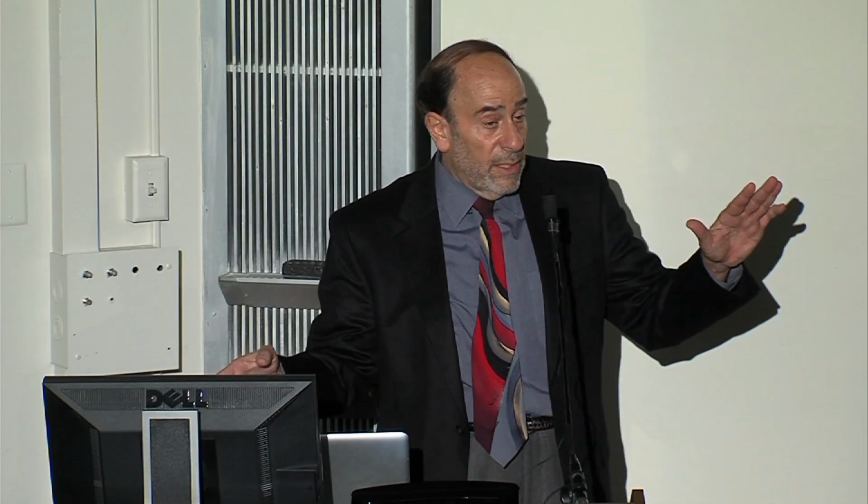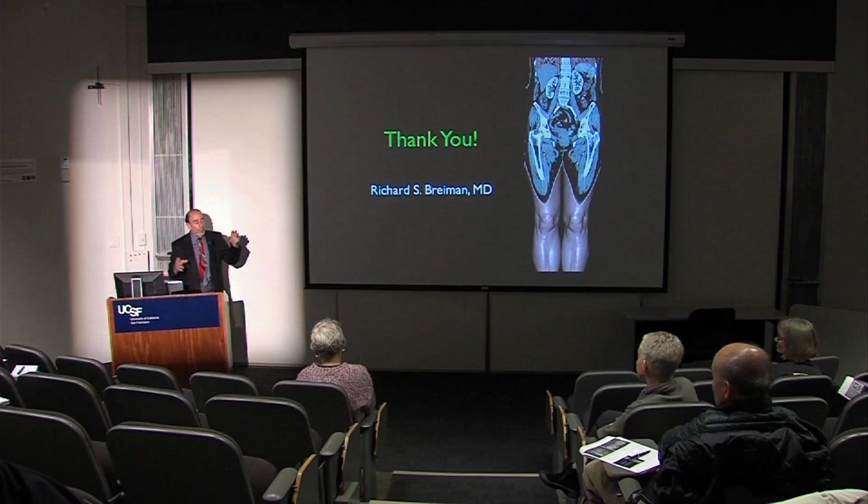Absolutely. I've done this, and I brought things from John Muir on a family member to UCSF. We can take that CD, load it into our own system, and I can see it on that workstation that I was showing you, and so can everybody else in our department, no matter whether they're at Mission Bay, at Mount Zion on Divisadero, or here. We'd put it up on one screen. If we're doing a new study on that patient, we'll have the John Muir study next to it, and we'll compare them as if we did it. Now, it might look a little different because they designed different protocols, or their scanner just looks a little different, but it's all readable.